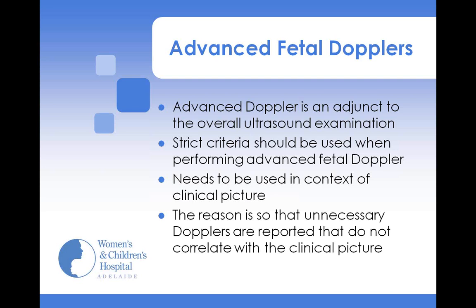The reason is that unnecessary Dopplers are being reported that do not correlate with the clinical picture. So there's nothing suspicious, the patient is doing well, baby's growing well, fluid's normal, umbilical Doppler is normal, someone does an MCA and it's abnormal. It just doesn't make sense.